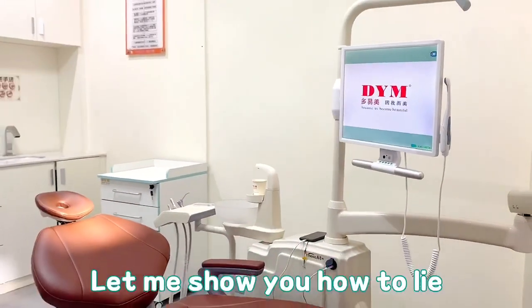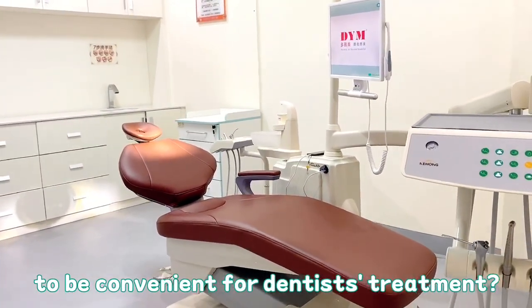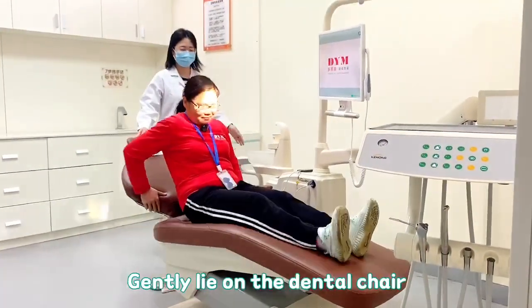Hi everyone. Let me show you how to lie in the correct position on the dental chair. To be convenient for the dentist's treatment, first, sit flat on the dental chair with your feet forward. Then gently lie on the dental chair.